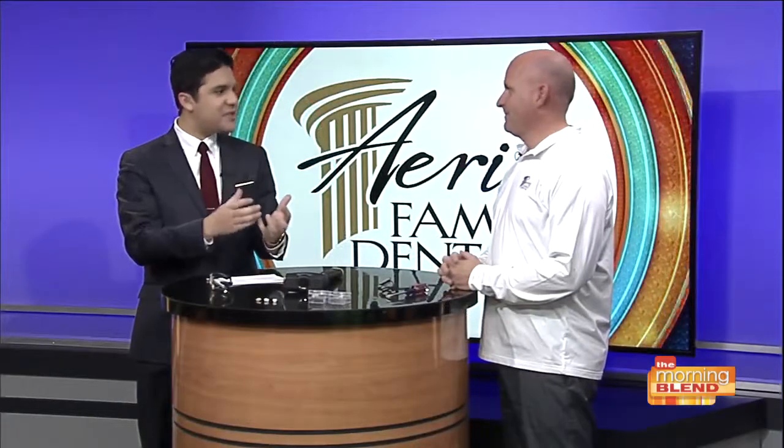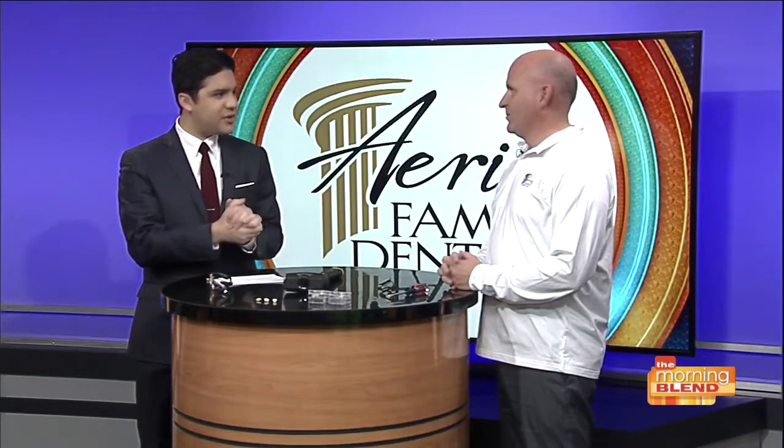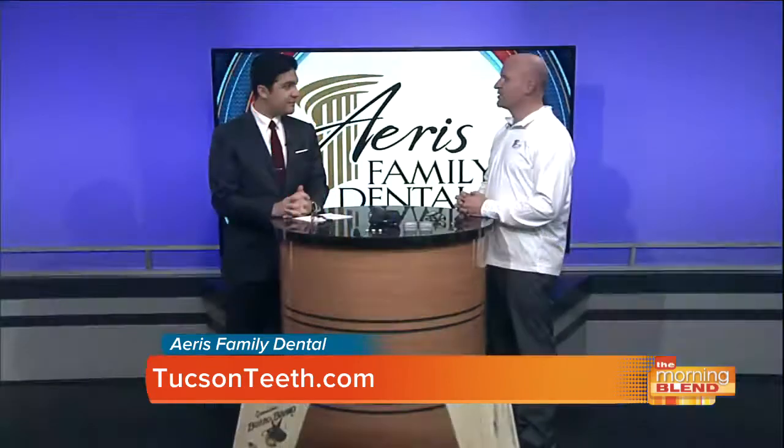So we're talking about crowns and the different materials that are used these days to fit them and make them. What types of materials are used these days? In the past, we've gone everywhere from a full metal surrounding crown, say like gold, and then you'd have a metal crown, you'd bake powder and liquid porcelain on top of it, and then we moved to kind of monolithic or one-piece materials that were milled out. And so now we are in two main products: lithium disilicate, and one is zirconia, and that's where we're focusing most of our attention nowadays.